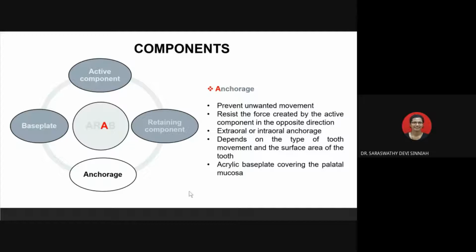The anchorage provided will depend on the type of tooth movement and the surface area of the tooth. With the removable appliance, it is difficult to prevent tipping of the anchorage teeth, but it can be controlled with adequate adaptation of the clasp and bows.